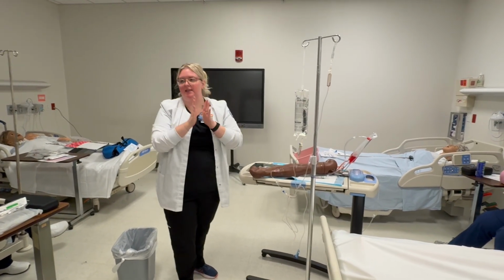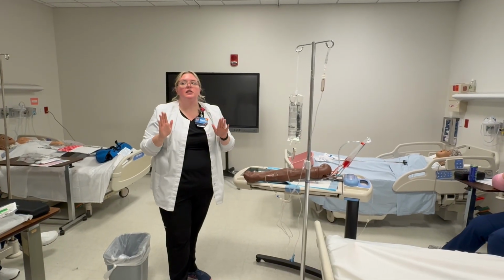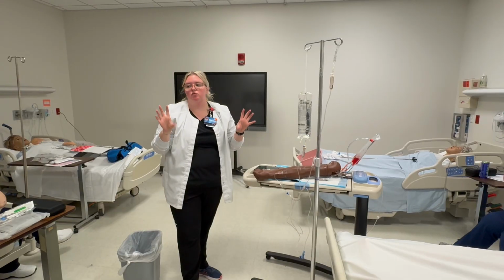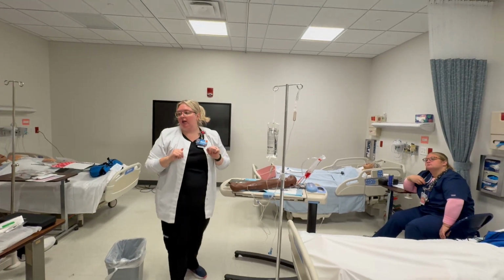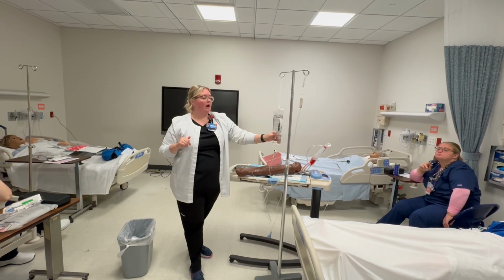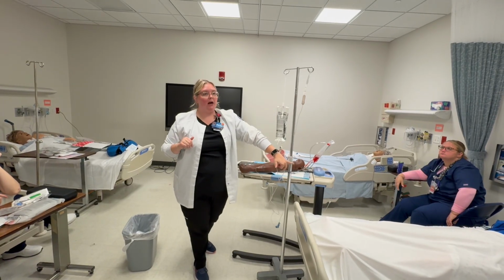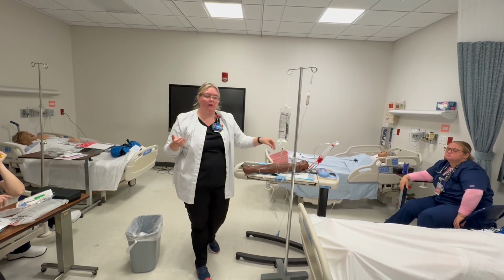Whoever sets theirs up first, you'll see what I mean, and we'll stop and look at it. This should be dripping, this one should not be. That means just my antibiotic is infusing and not my primary. Then when this one runs out of air, this one will start. We're not doing that in checkoff. We aren't waiting on that.